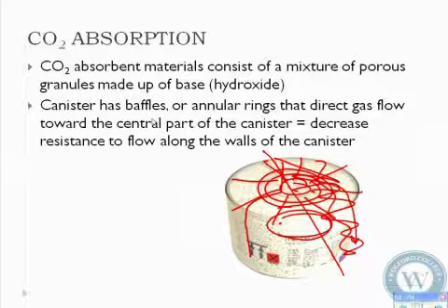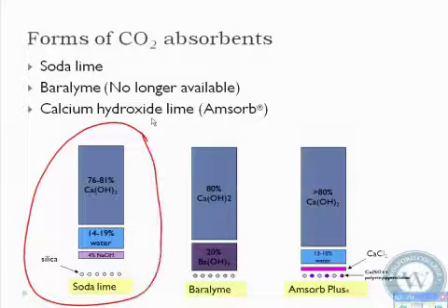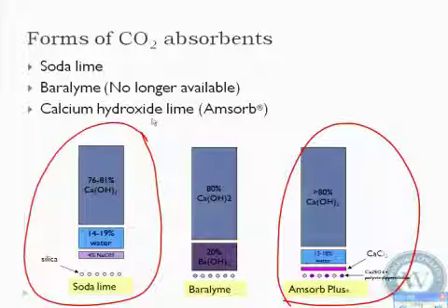And whenever you take one of these out of the package, you're supposed to shake it a little bit. All right, shake it. That helps even packing of the entire thing. All right, so this is the most common type of absorbent that we use. This is the cheapest. It's highly effective. This is a good absorber too, but this thing is much more expensive and it doesn't last near as long.